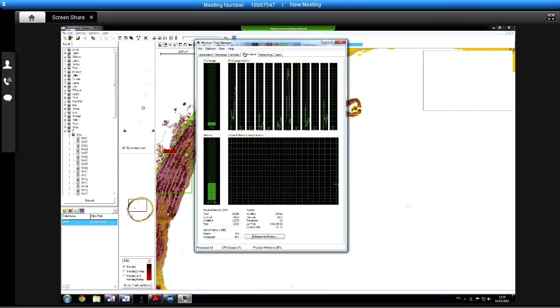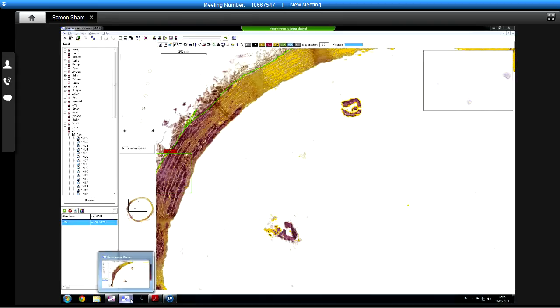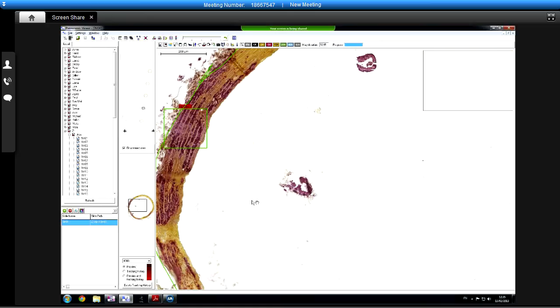It's gone away. That means it's finished. It was hovering on, it had one left. I better not click things too quickly.